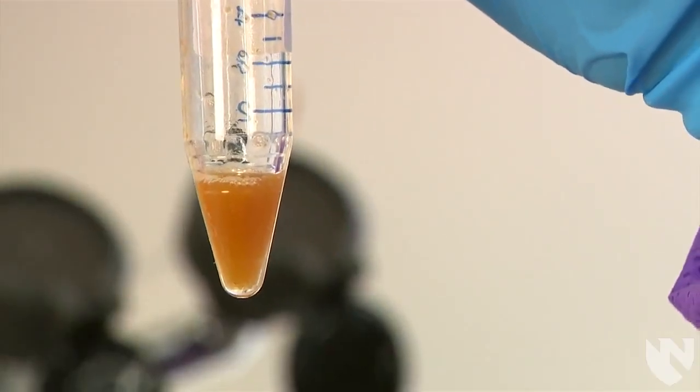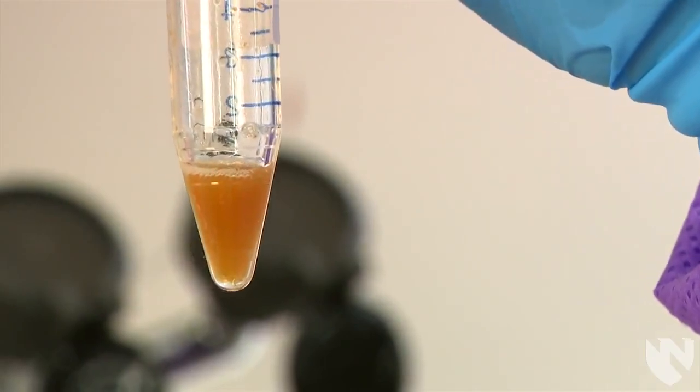Once the sediment has been completely re-suspended, your sample is ready to be used to make a wet prep slide.